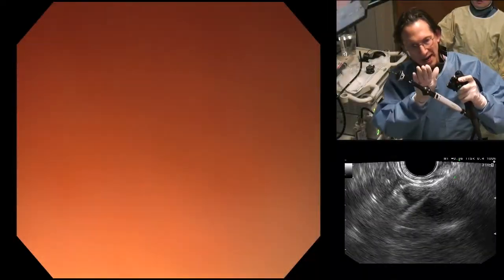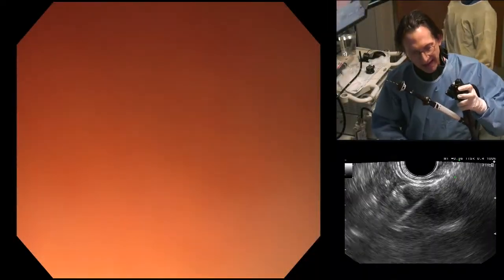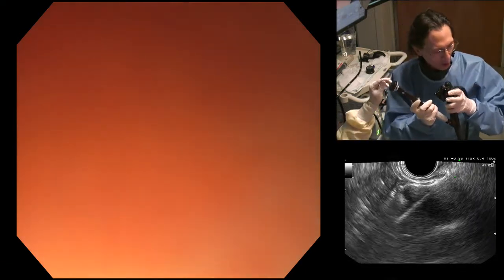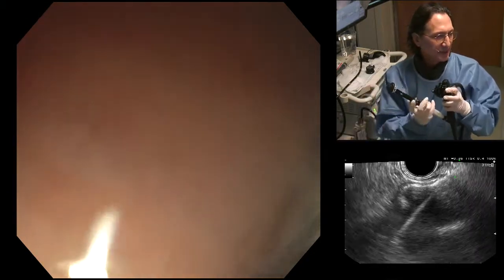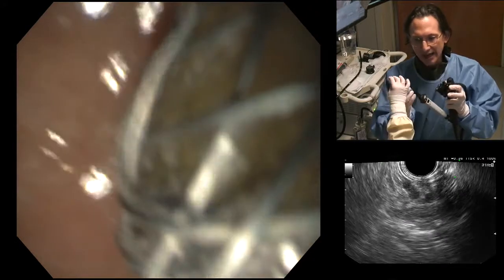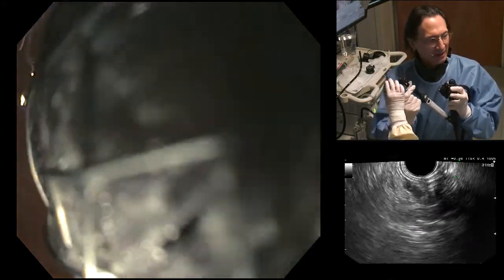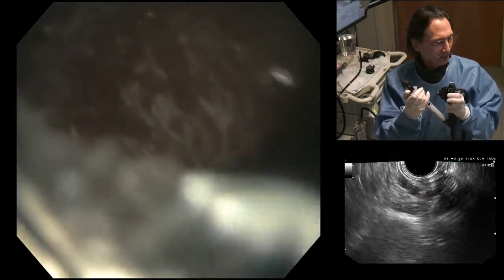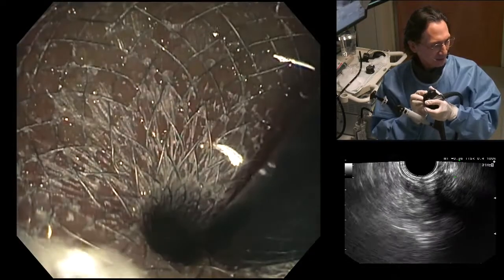Now, you see we have a red out, but I'm now going to give some air, and what I'm going to do is as I'm backing off from the wall, let me just check this is unlocked. So this is unlocked. As I'm backing off from the wall, look at the endoscopic image. You can see the end of the stent. I'm pushing it out. I've pushed it out, and to push it out completely, I advance this gray hub here like this. All right, so now it is deployed. All right, here we are.